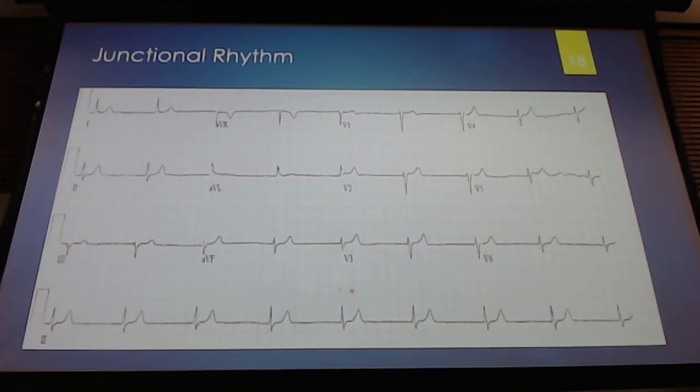And we don't see any P waves. There's no P wave, none. No P waves anywhere around here. We have our QRST, that's junctional. That's junctional every day with no P wave. If you had an inverted P wave, still junctional. If you have upright, no. Upright P wave tells you that's coming from the SA node. Okay? This is a junctional rhythm, 40 to 60.